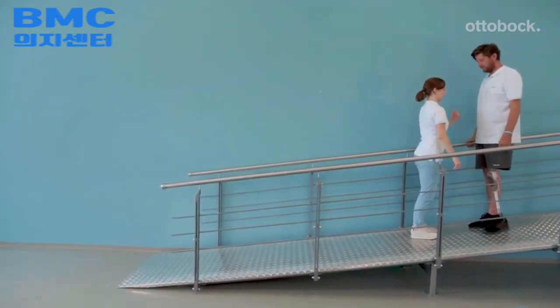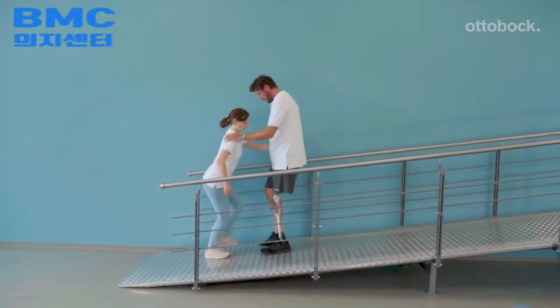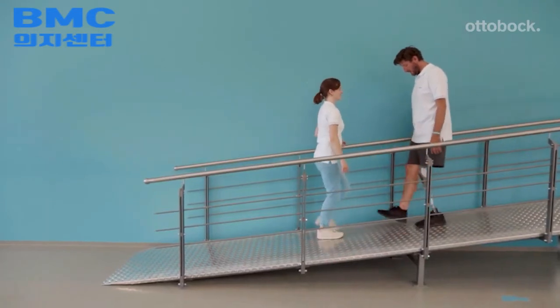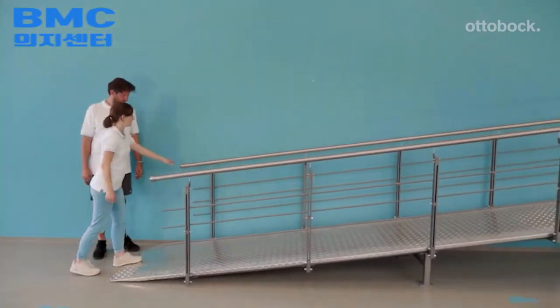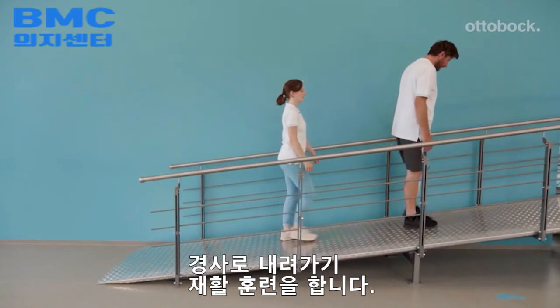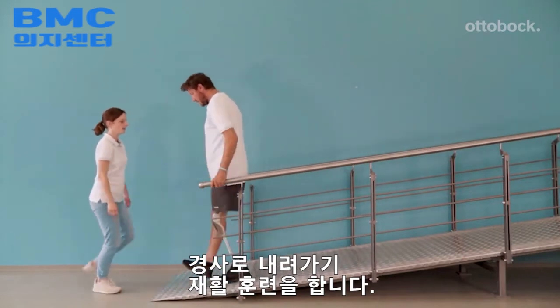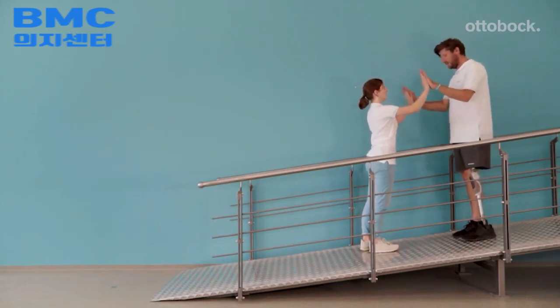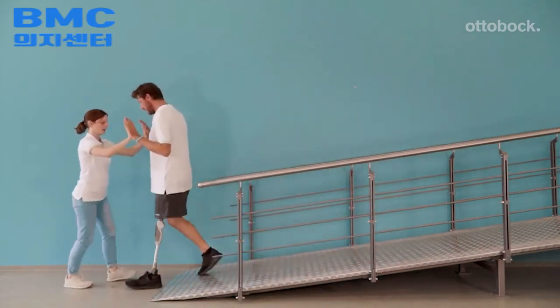With progress, the therapist reduces support but can still provide correction as necessary. When the model is confident enough, he should practice going down the ramp without assist. Change the side of the handrail as confidence increases. The steps should not be too big, as the model might go too fast and risk a fall. An adjustment of stance flexion resistance might be necessary by the CPO.